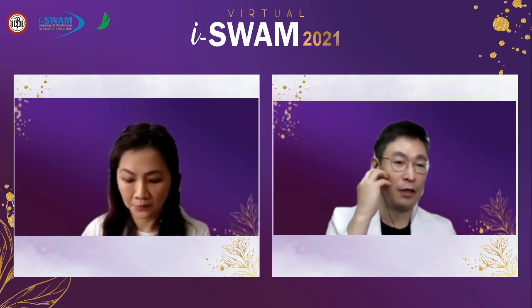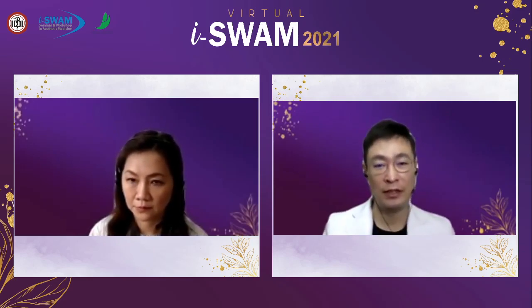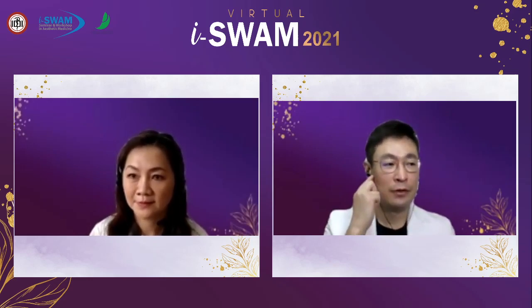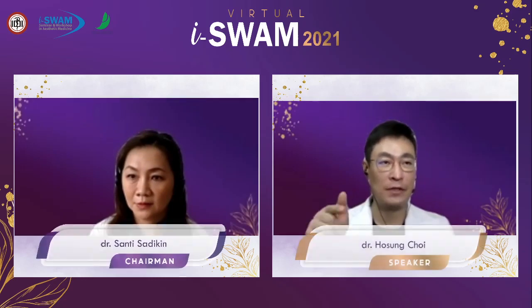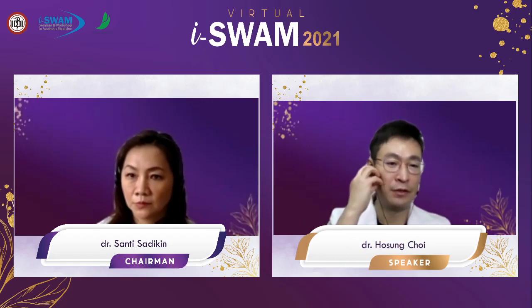So I should fill about 70% only, because I'm not injecting only the filler. I first put 50 to 70% of the volume loss, and then I put the thread to reposition this part to fill the sunken area.